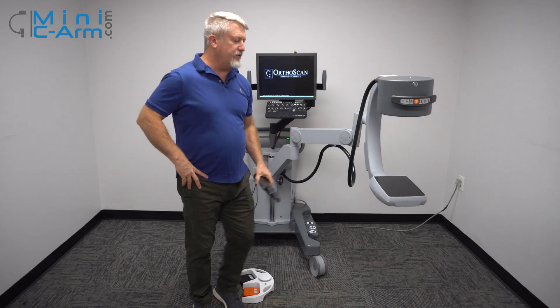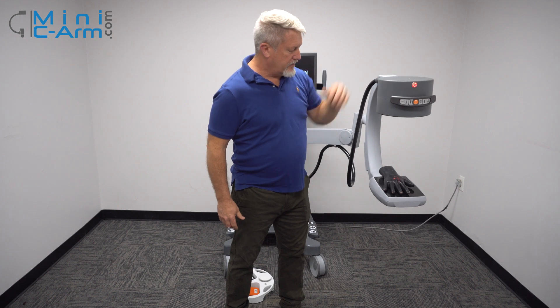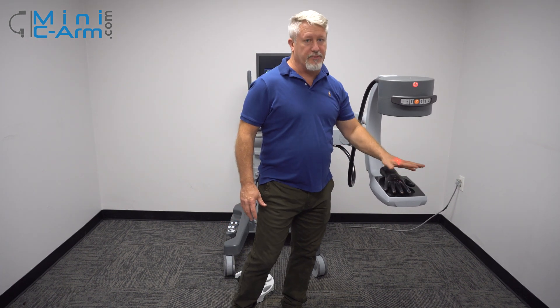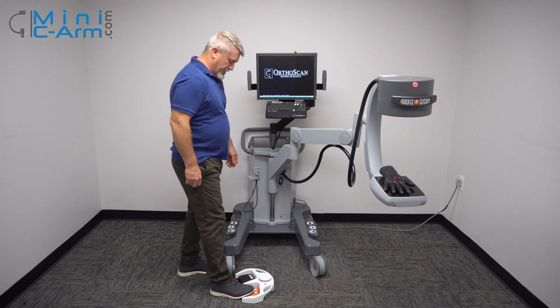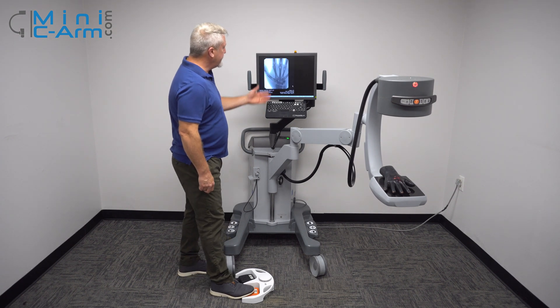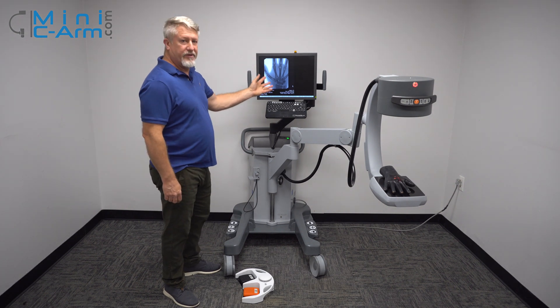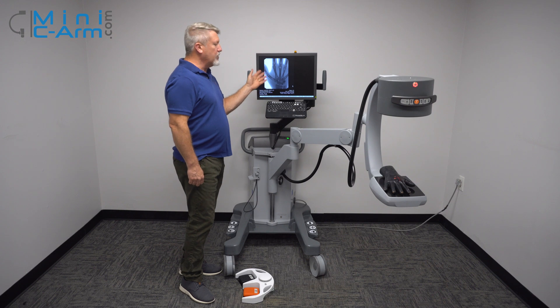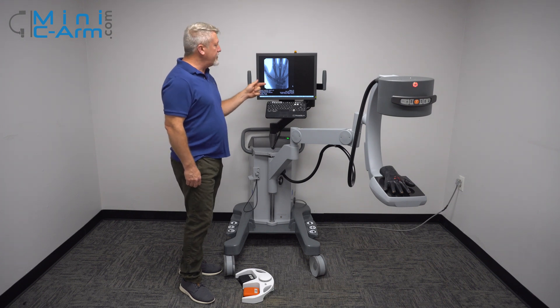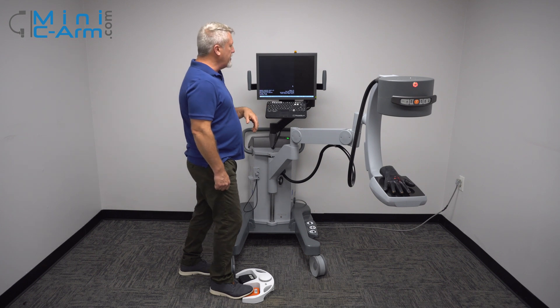We're going to use our hand phantom to do some imaging. There is a laser button up here that gives you crosshairs approximately in the middle of the field of view. It takes approximately three seconds to get yourself a nice image. Please don't just tap — you'll get an unsatisfactory image. Also wait approximately a second before you initiate another fluoro.